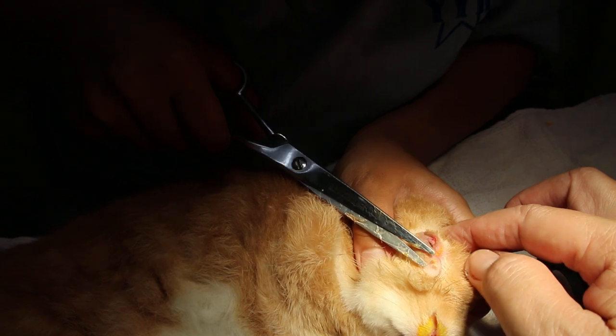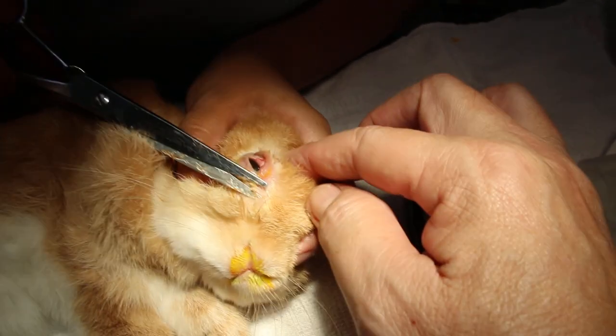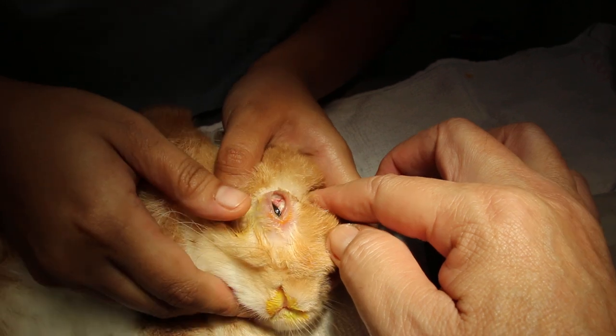You can see — we open up. You can see there's no cornea ulcer.